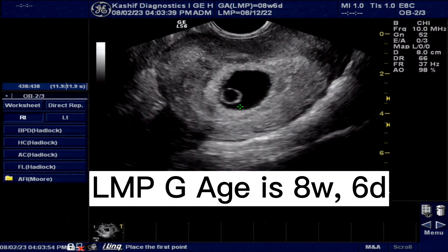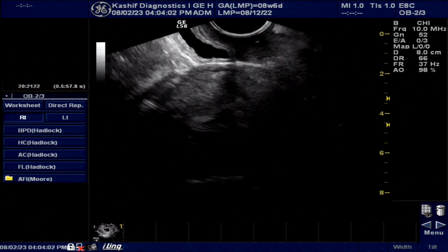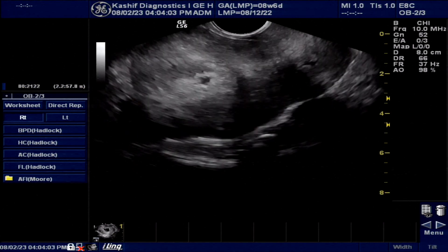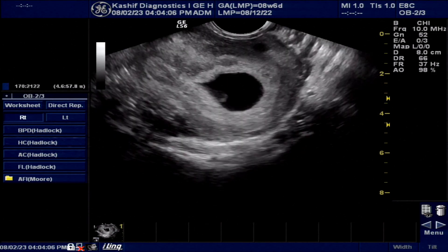This is an obstetrical scan with LMP gestational age 8 weeks 6 days. No symptoms from the mother, no spotting or bleeding — just a routine scan.